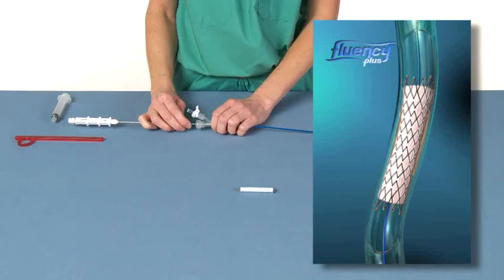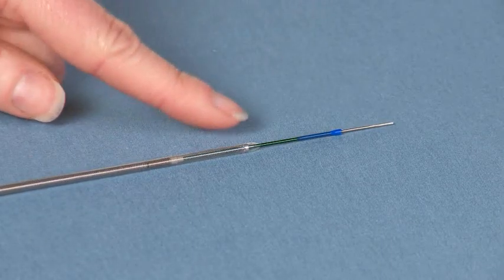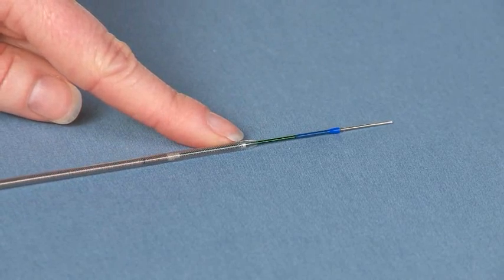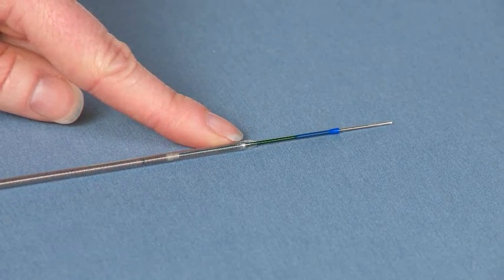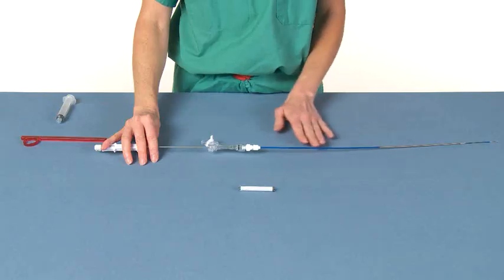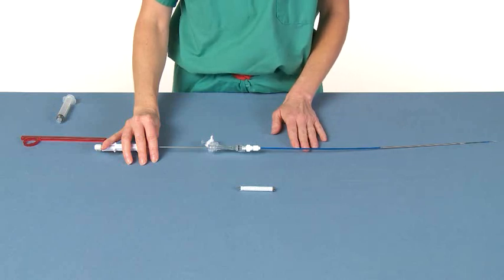The radiopaque tantalum markers on the stent graft ends should not move laterally during stent graft deployment. However, the radiopaque marker band on the outer catheter moves backwards during stent graft release to indicate deployment of the stent graft. Be sure the operator does not hold or kink the outer sheath of the delivery catheter, since it must be free to move during deployment.